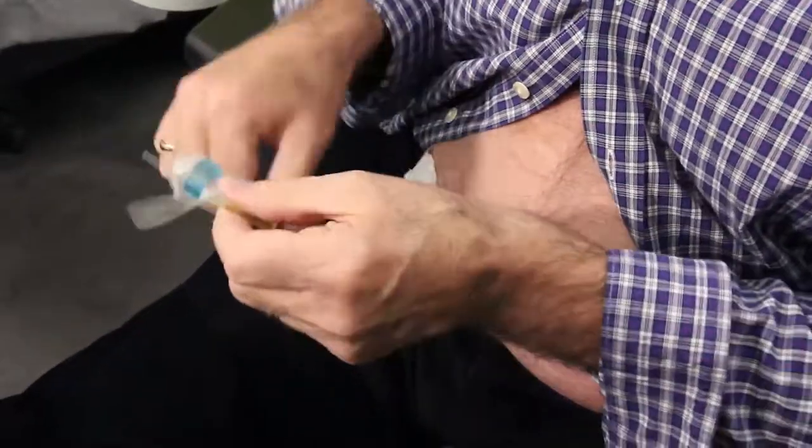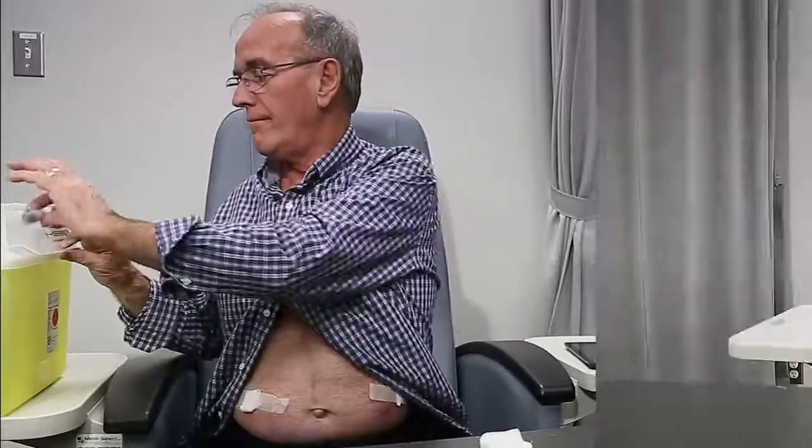Dispose of the used needle in the biohazard container. Complete the treatment log as instructed by your health care team using the lot number sticker you saved from the syringe. Way to go! You have completed your first infusion.